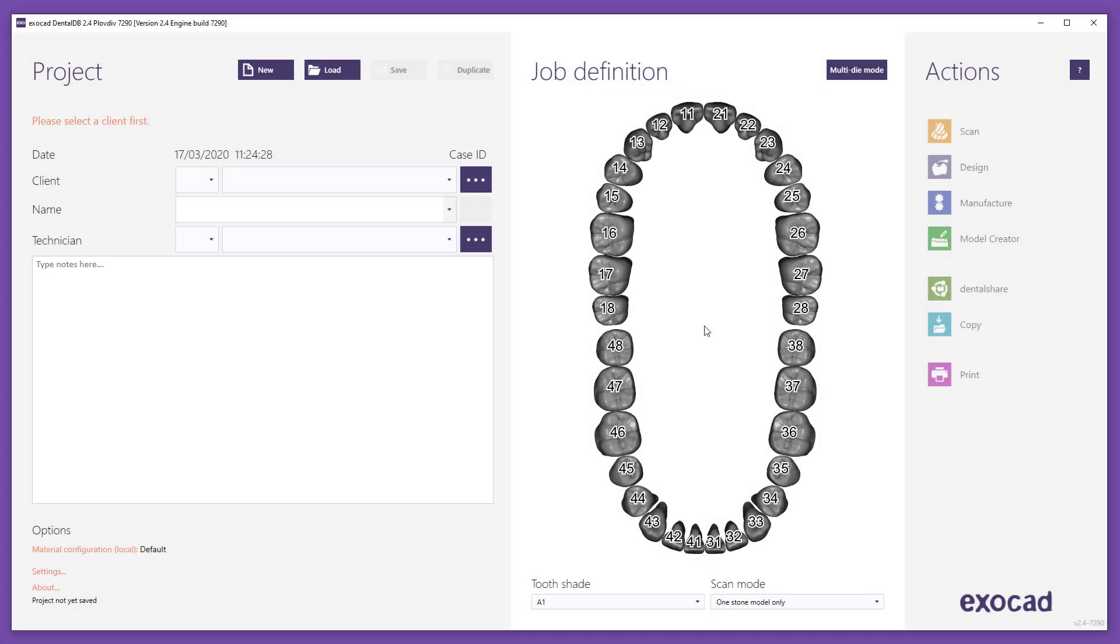This video tutorial from ExoCAD will demonstrate how to use DentalShare to enable online collaboration between different users, clinicians, dental technicians, and production centers. For the purpose of this video, we have chosen a purple border to signify the sender and an orange border to show the recipient.